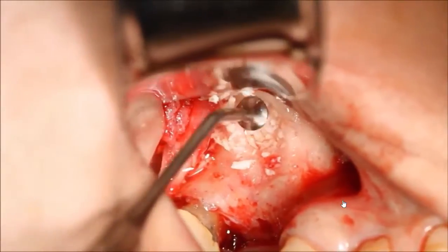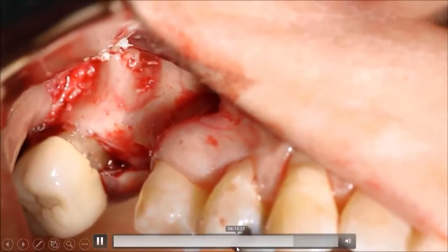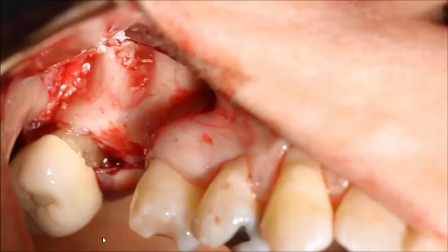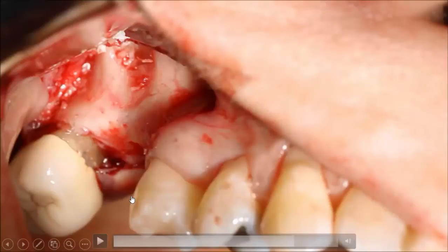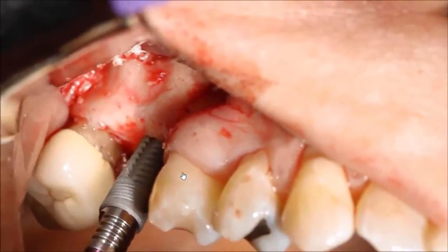نعمل packing للبون graft gradually incrementally. بنحاول طبعا إنه make sure إنه البون graft packed medially and anteriorly. هلا لازم هو الحقيقة ناخد X-ray قبل ما نحط الزرعة حتى make sure that we have good sinus lift with the bone graft. أنا هون في خطأ بالكيس ما عملت الإكس-راي. والأفضل إنه يفضل إنه نحط نحن بون جرافت ضمن الأوستيوتومي قبل ما نحط الزرعة وبندفش البون جرافت بالزرعة. كمان هون ما حطيت البون جرافت.